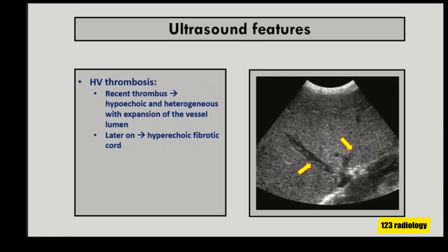Hepatic vein thrombosis can be total or partial, focal or extensive, and may involve one or more hepatic veins. On ultrasound, acute thrombosis is hypoechoic and associated with expansion of the vessel lumen. On color Doppler ultrasound, no flow is seen in the thrombosed segment.